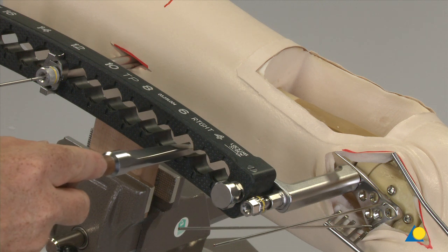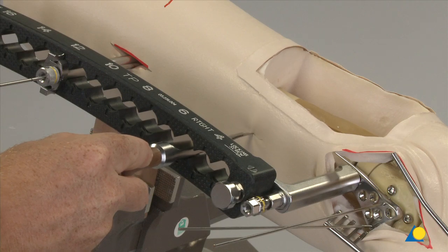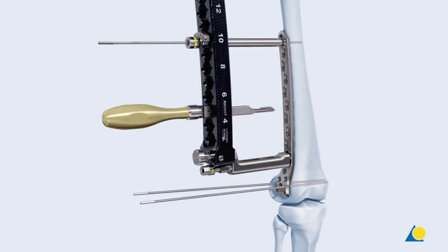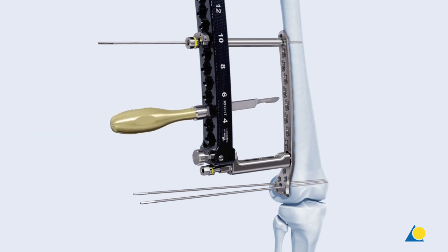Pass the scalpel through the corresponding hole in the aiming arm and make a stab incision. If the direction of the blade must be changed, it should be backed out, rotated 180 degrees, and reinserted through the aiming arm.